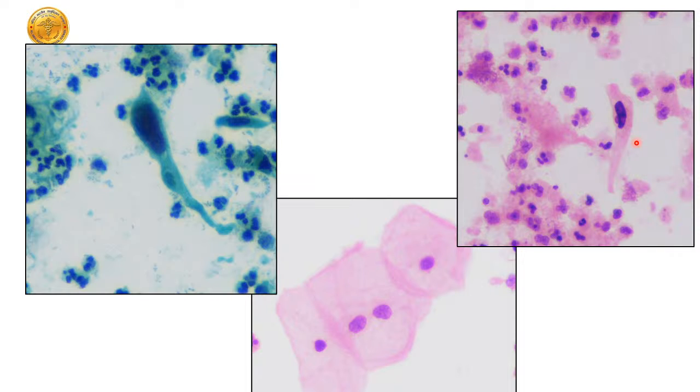So this is what we would call a tadpole cell, fiber cell or tadpole cell. Keratinized cells with markedly hyperchromatic nucleus, which is irregular, look at it here, and for comparison, a nice, neat squamous epithelial cell here. So we said this was possibly high-grade urothelial carcinoma with squamous differentiation, which is known to occur in about 25% of the urothelial cancers.